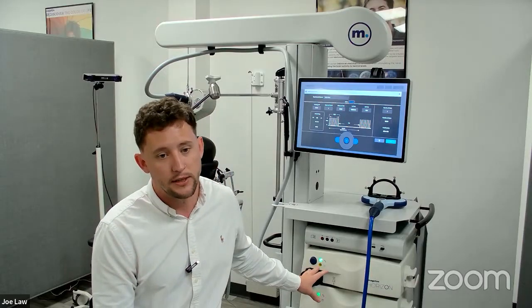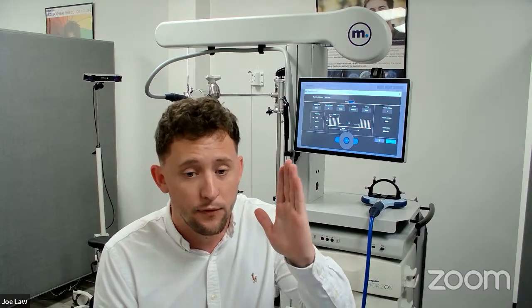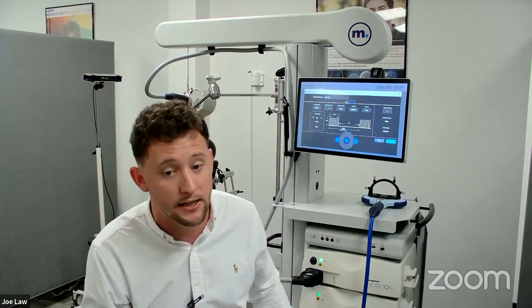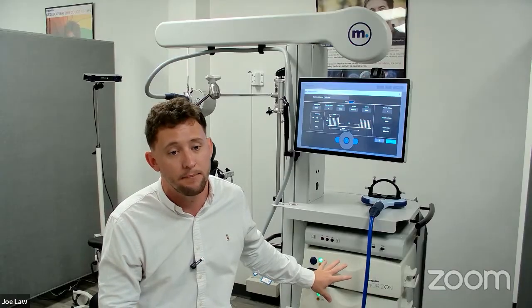So there's something called coil decay, or pulse decay. The way that works is Magstim has an energy recovery system. When the treatment begins, the first pulse that is delivered to the patient will be equivalent to the last pulse. There are other devices out there that suffer with something called pulse decay, meaning every time the pulse is fired during that treatment, you get less and less of a pulse, because they don't have an energy recovery system like Magstim.